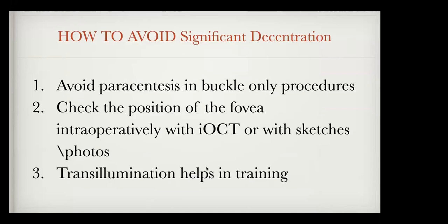So my message is, if you decide to redo and replace the suture, do it one day after. Or let's say if you operate in the morning, just check a few hours later. And if you have to redo it, do it immediately. It's much, much easier.